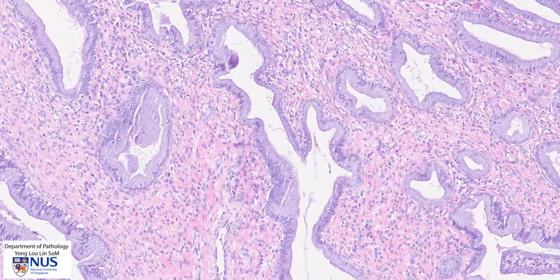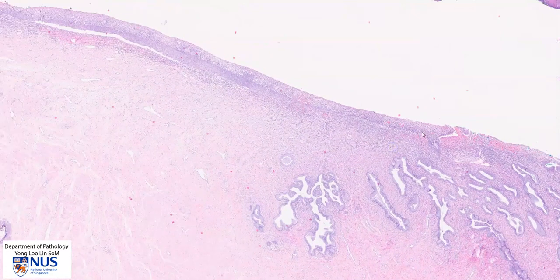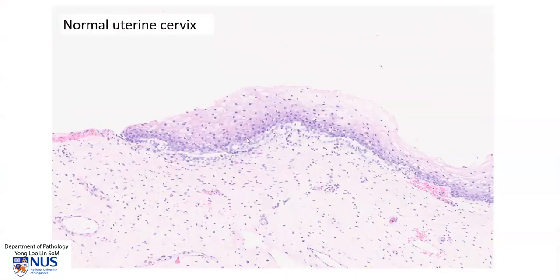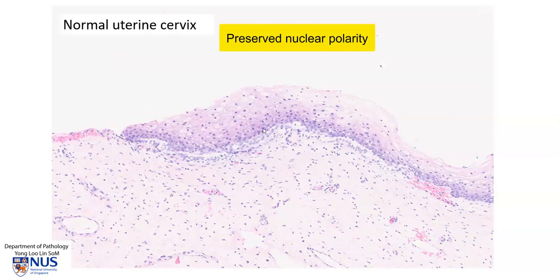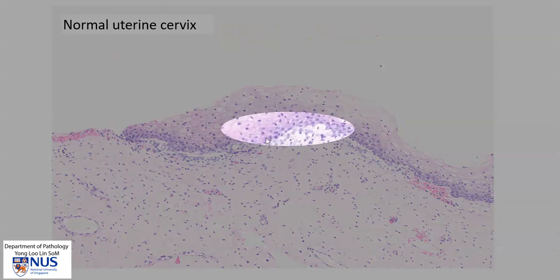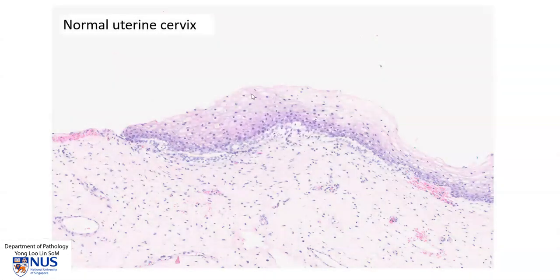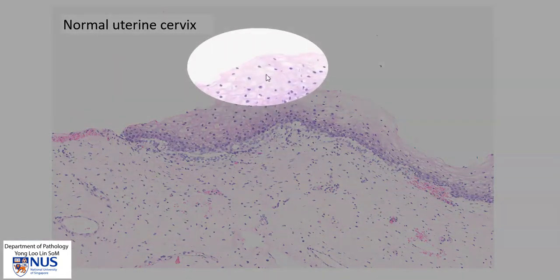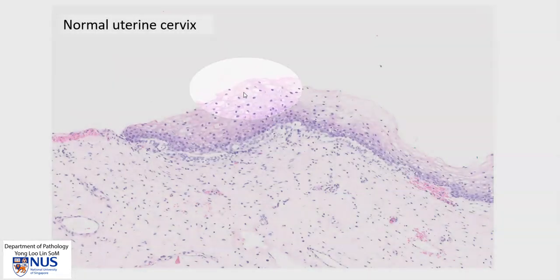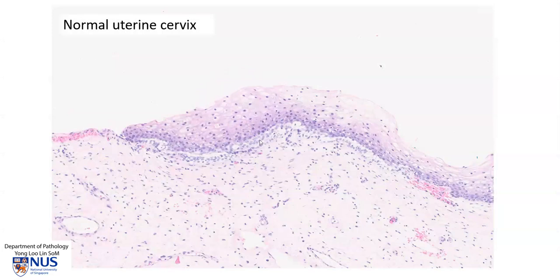Now let's look at the surface epithelium. The entire length of the ectocervix in this particular section is abnormal, but first let me show you what normal ectocervical epithelium looks like. In the normal uterine cervix, the ectocervical epithelium is non-keratinizing stratified squamous epithelium. This example shows polarity of the nuclei — the basal-most nuclei tend to be darker with higher NC ratios, whereas towards the surface the nuclei get smaller, the cells appear more flattened with more cytoplasm, hence a lower NC ratio. This maturation is a good sign that we are not looking at neoplastic squamous epithelium. This is the benign cervix with maturation and preservation of nuclear polarity.